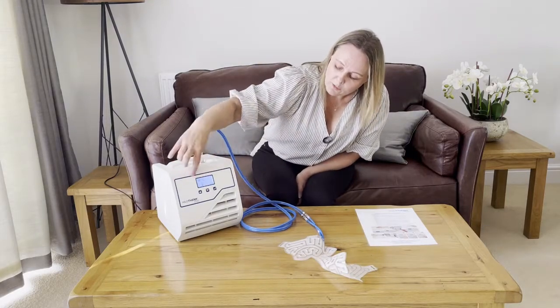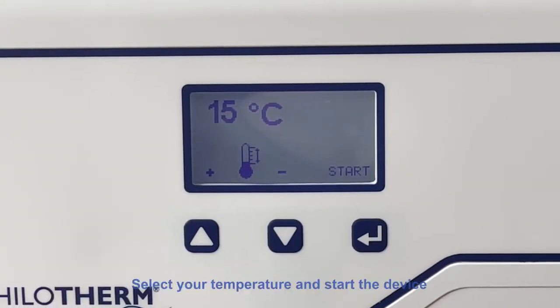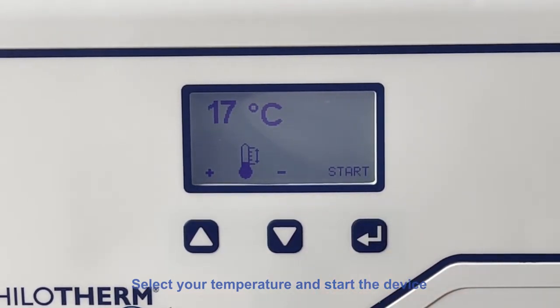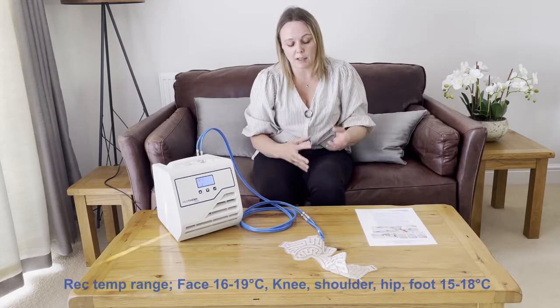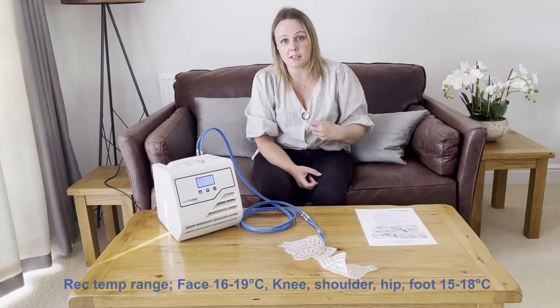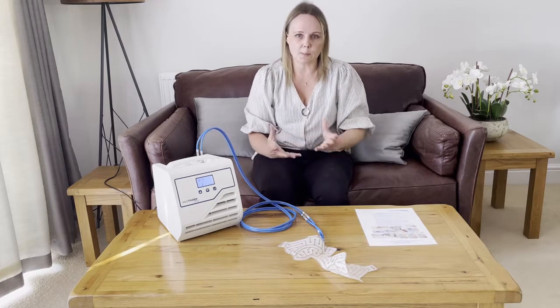Once the machine is turned on, you can adjust the temperature using the up and down arrows. The normal recommended temperature for the face is between 16 and 19 degrees, with 16 being the colder temperature. For the knee, foot, or other orthopaedic or body surgeries, we normally recommend between 15 to 18 degrees. If you have thicker bandaging you might want to take the temperature down to around 12 degrees. It's worth bearing in mind that HyloTherm is a temperature controlled treatment — it's not like ice; you're not aiming to go as cold as possible. Because HyloTherm isn't like ice, you can use it continuously 24 hours a day if you wanted to, so please select a temperature that works best for you or your patient.